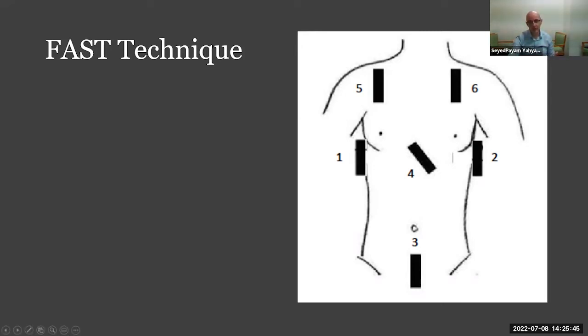So I tend to start with the anterior parts, looking at the pneumothorax first, especially if it is suggestive of potential pneumothorax. It can and it should be fixed straight away. Then I go for the sub-xiphoid, looking at the heart to see if there are any signs of tamponade, because again, it can and it should be fixed straight away.